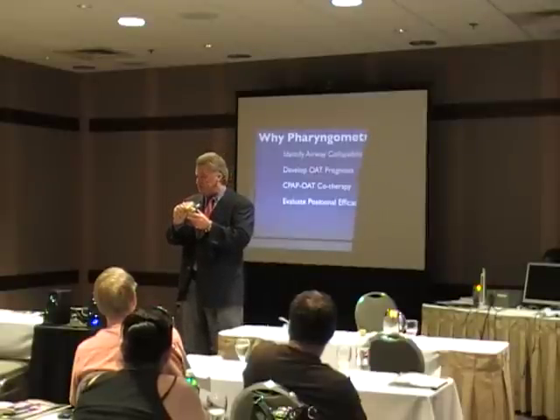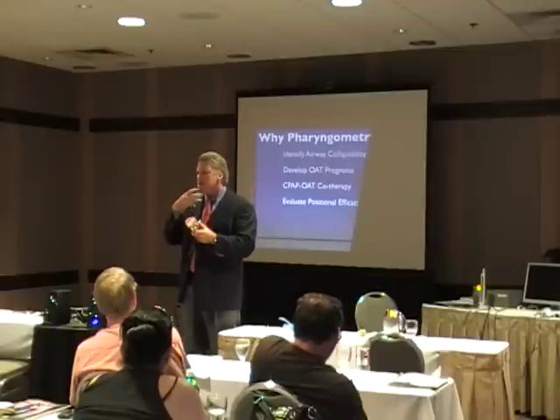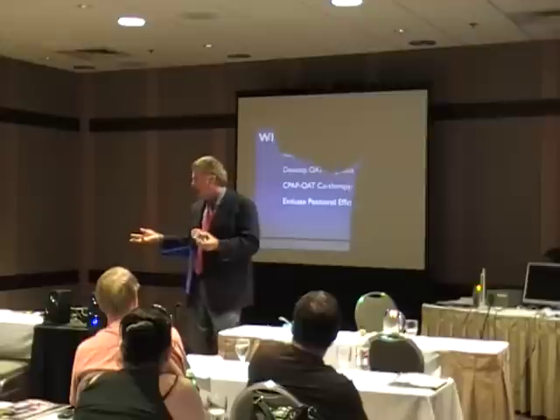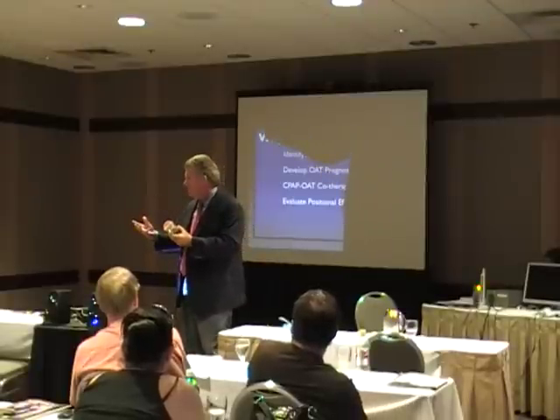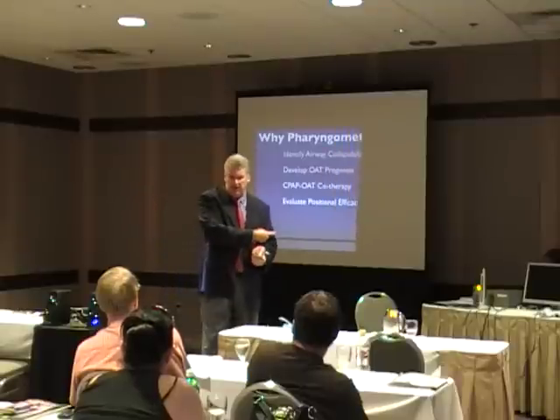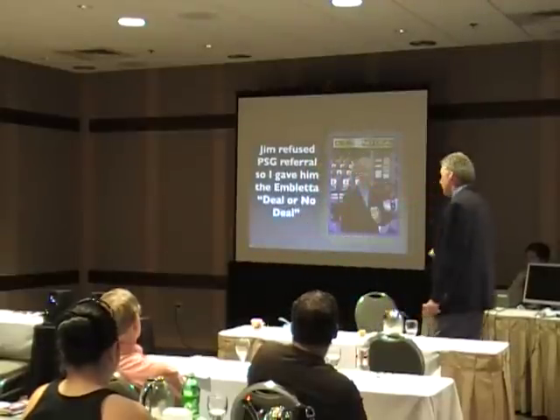Is that substantive in terms of maximizing airway? Yeah, you've got AP, but you're also going to have vertical. So how would you know how much vertical to add? I mean, what would be a guide? Rolling the dice? Throwing a dart? Or maybe measuring. So we do this in Embletta Deal or No Deal all the time.